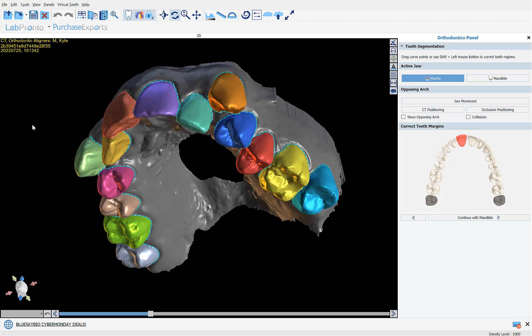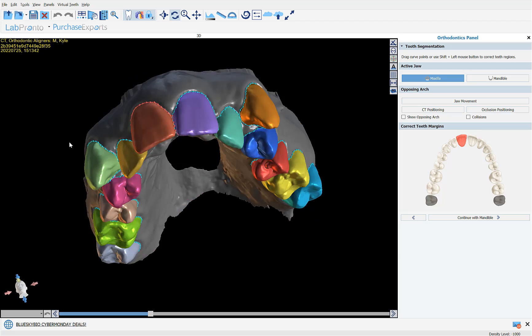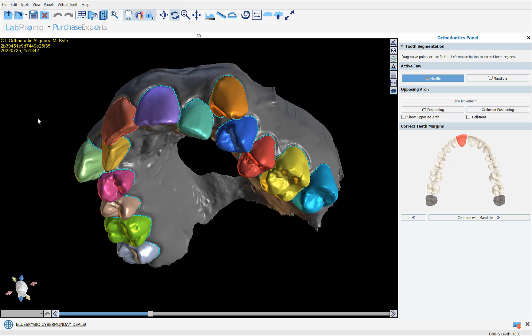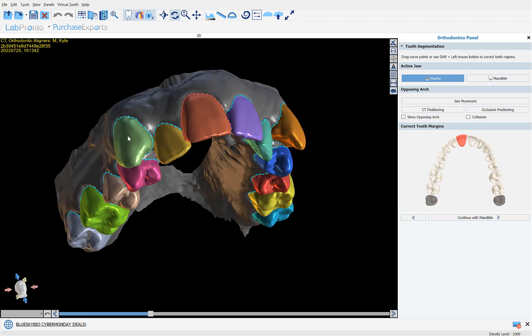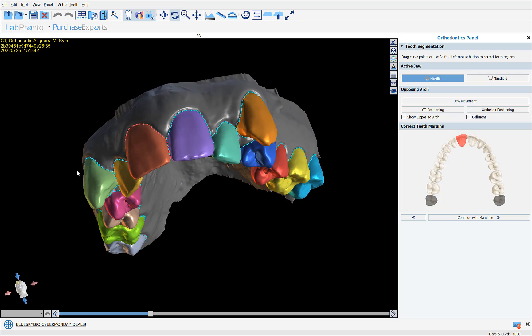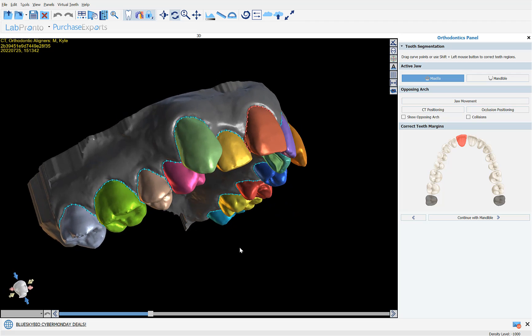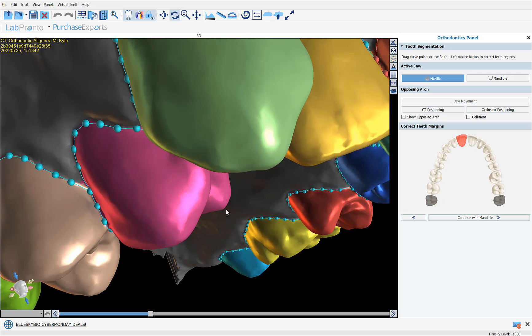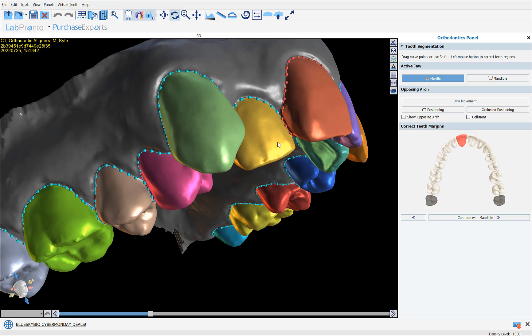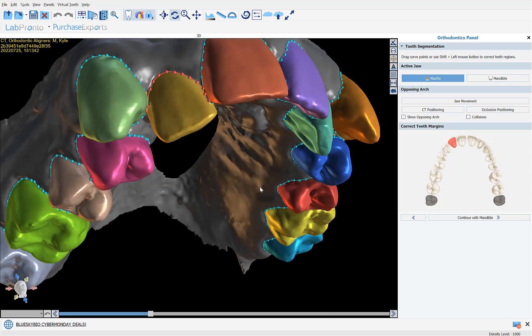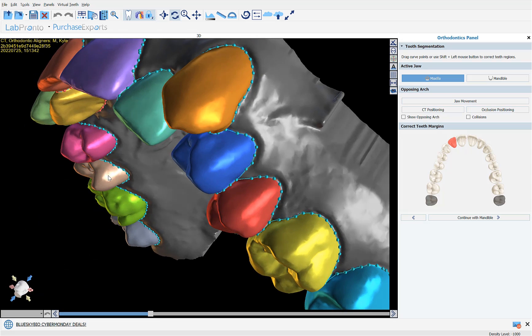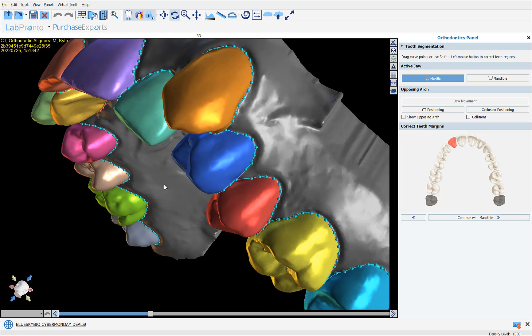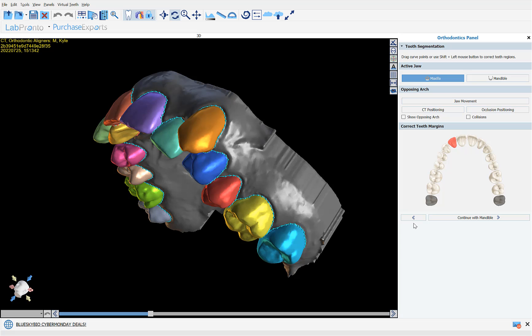We can see on screen the teeth as automatically segmented by the software. We can make any adjustments if necessary simply by clicking on a tooth, having the border highlighted in red, and grabbing and dragging any of the nodes. In our situation the segmentation seems to be spot-on, so I'm going to click continue with mandible.